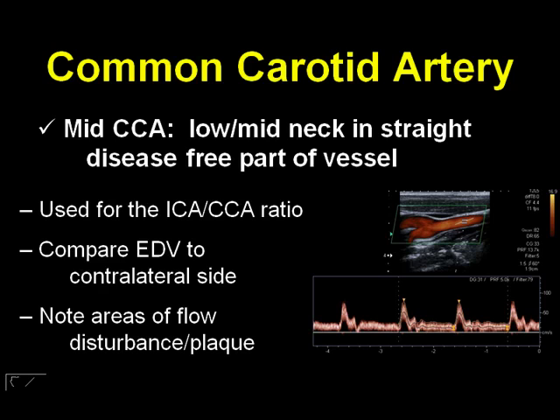And what we do is we allow the color flow image to tell us where we need to stop within those areas of those predetermined sites for evaluation. Any area that looks suspicious by the color flow image really should be evaluated by spectral Doppler. In the absence of any evidence of a flow disturbing lesion or any other pathology within the carotid system, of course, we would stop at those predetermined sites to evaluate and to acquire velocities.